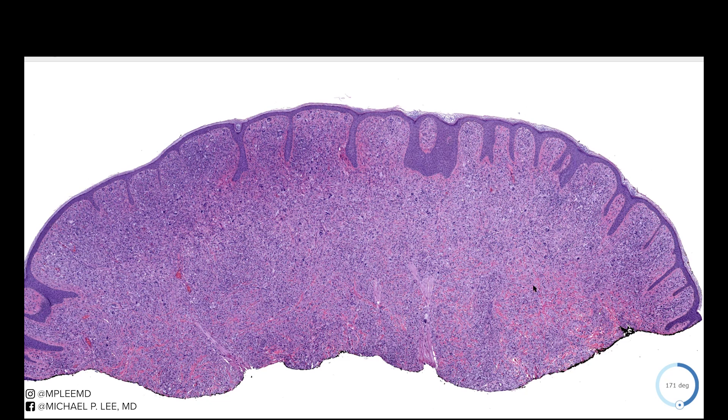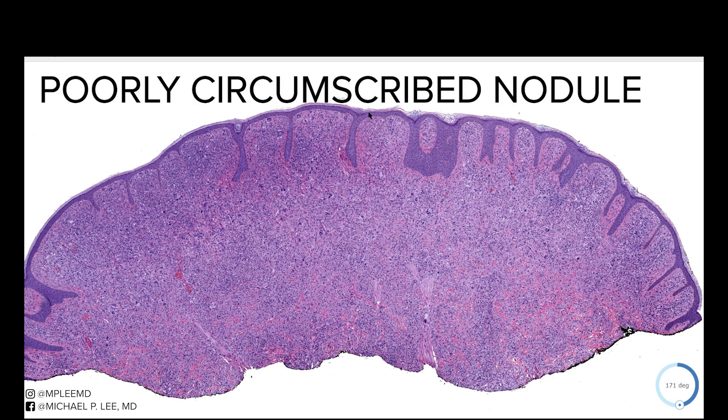The way to approach this biopsy: we have a sort of dome-shaped papule that's lifted off the epidermal surface. It'll feel firm, and what we see in the epidermis is that it is somewhat thin, and you have elongated rete ridges — or acanthosis.